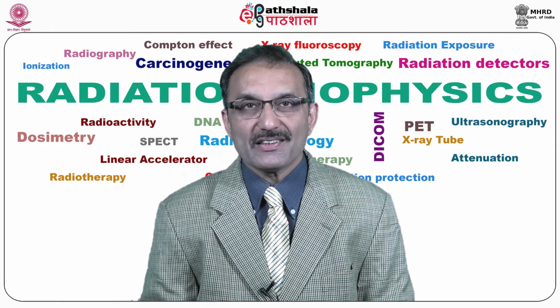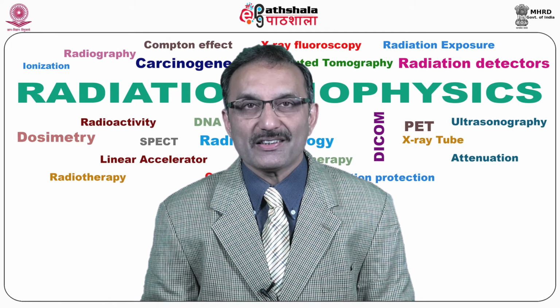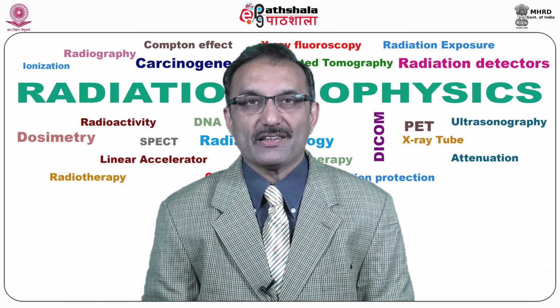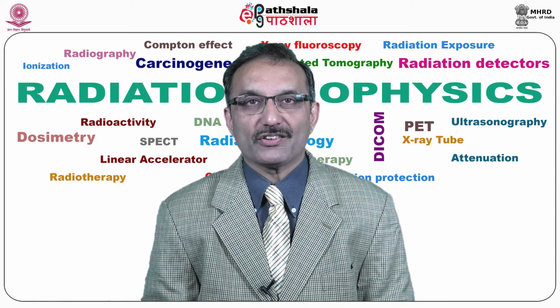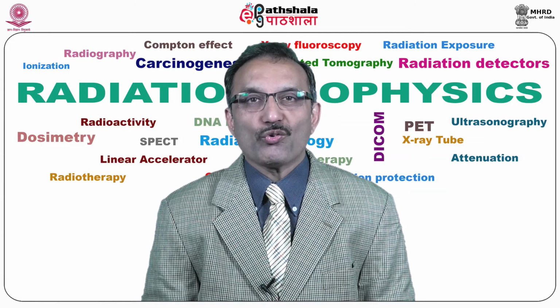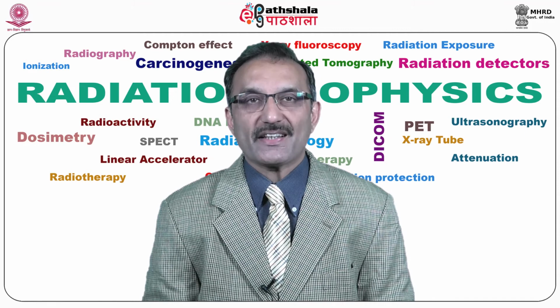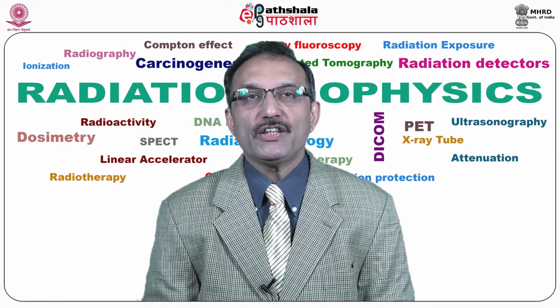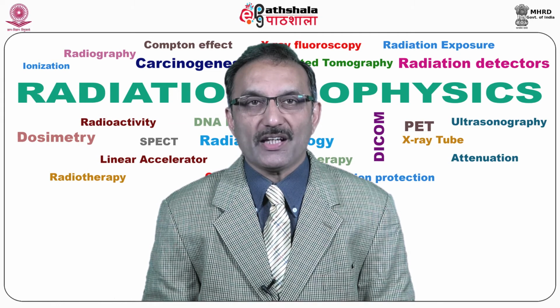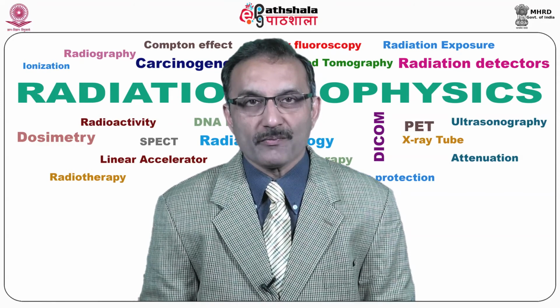It means when we talk about X-rays or CT or MRI, what do we get? We get the anatomical structure of the human body. But if you would like to know how the organs are functioning, this is the only technique available which utilizes radiopharmaceuticals to image, and it gives the functioning of those particular organs.